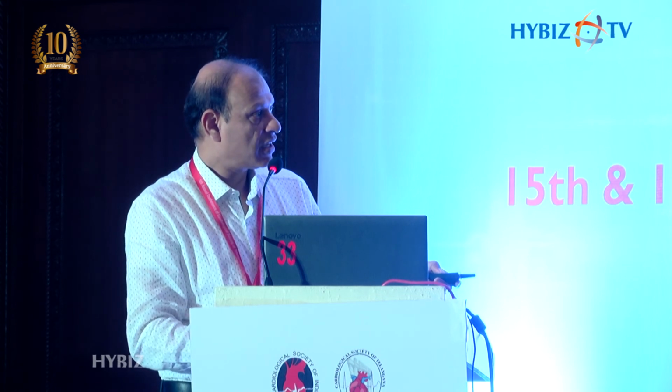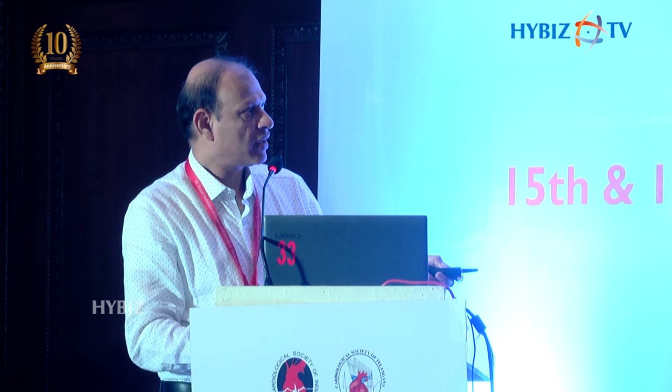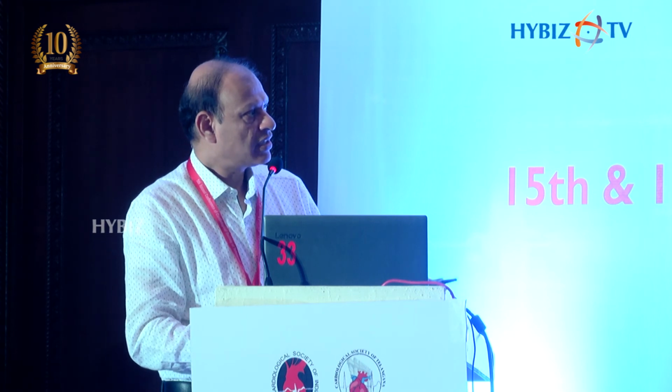What has OCT shown? When you have an MLA of less than 4.5 or 4, a distal reference narrowing, a significant plaque burden, distal edge dissection, or proximal reference narrowing, these are the important factors which decided that these patients would have a higher MACE with an angio-guided procedure when compared with OCT.